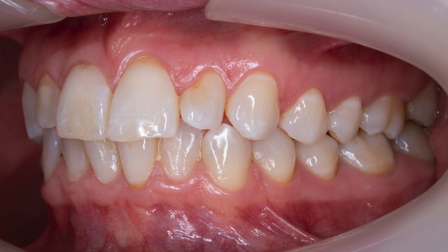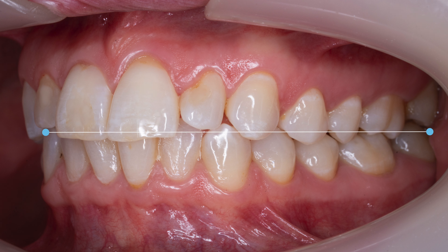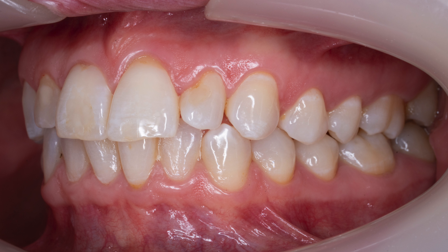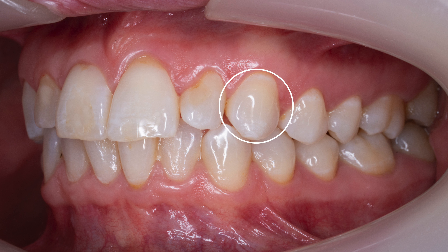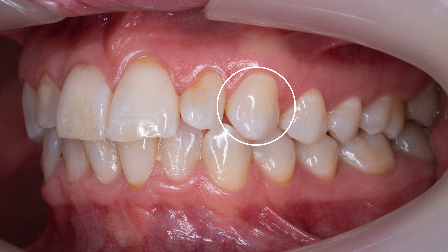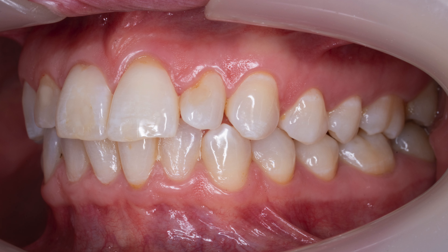When undertaking the oblique or lateral views, you are again aiming for the occlusal line to be straight in the frame, ensuring there is equal space on either side. You want to capture all the teeth from an oblique perspective, so you would aim for the canines to be perpendicular to the camera plane. Any further round and you will risk losing the posterior teeth from the image. If you are wanting a more lateral perspective, then you would aim to have the first molar perpendicular to the camera plane, which will likely require alternative retraction.